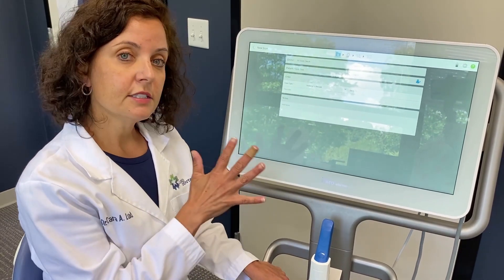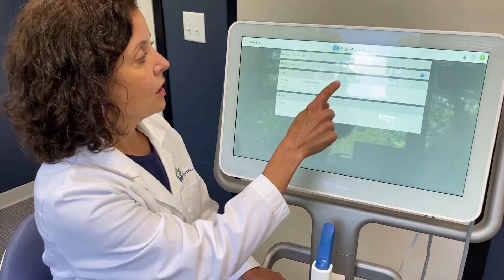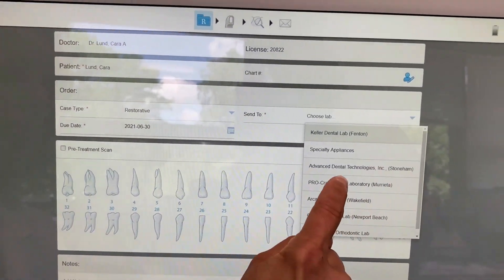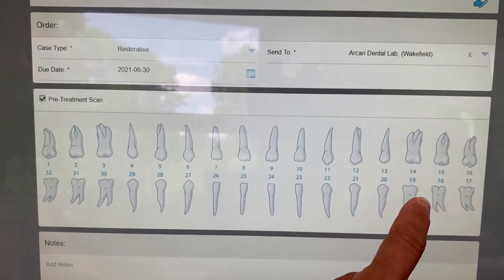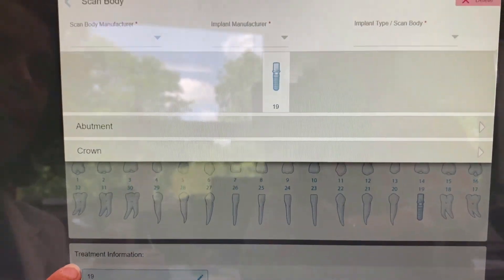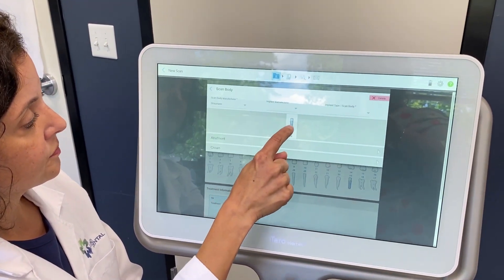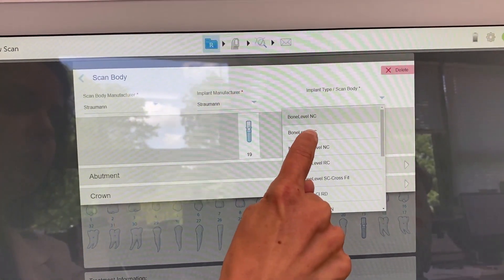So how do we scan? A lot of this is done before the patient enters the office. The assistant, knowing there's an implant crown we're going to scan for, will come in and enter the information. We'll pick our lab — your personalized list of labs can be in this area. For implants, we always do a pre-treatment scan because we're going to scan with and without the scan body — tissue level and with the scan body. We then enter the scan body information: who manufactured it, who manufactured the implant, and what kind of implant we're scanning.